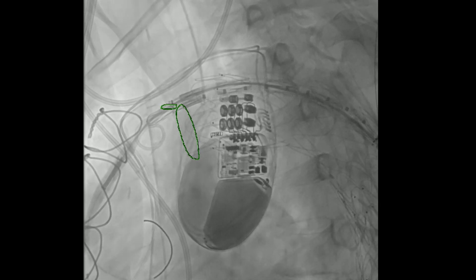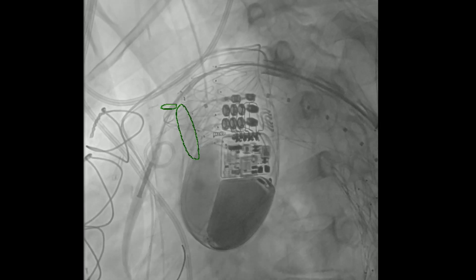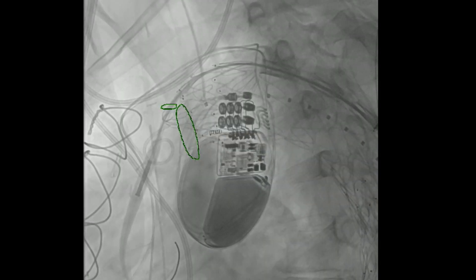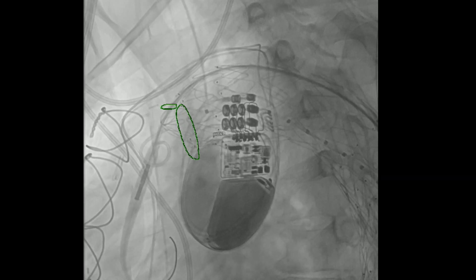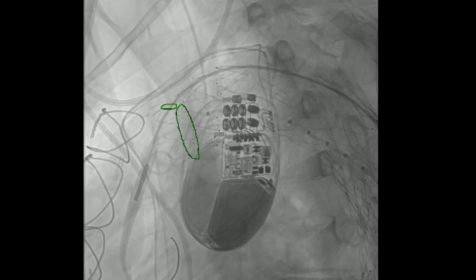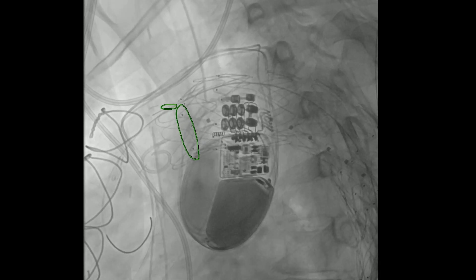We mag up and aggressively deploy the device. It's starting a little bit further forward than usual. Now we can see the covered part of the graft — we're putting it right on the subclavian. Beautiful, right on the subclavian. It may have come back a little bit. You have to remember that the pigtail was trapped between these two grafts when you come to take it out. We've released the attachment system and removed the device.